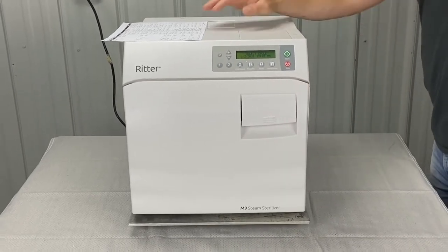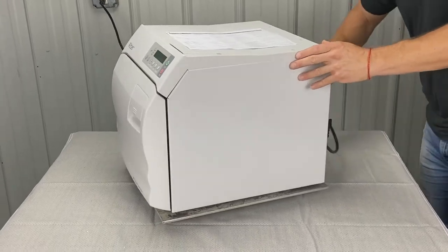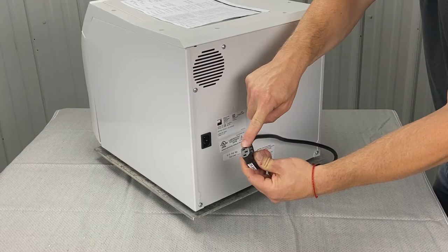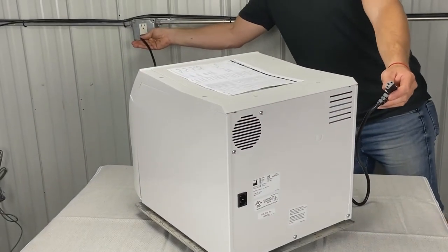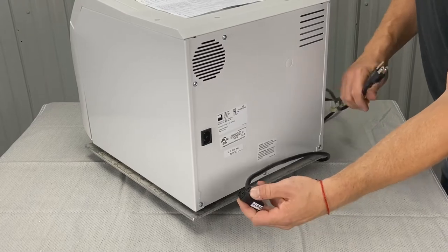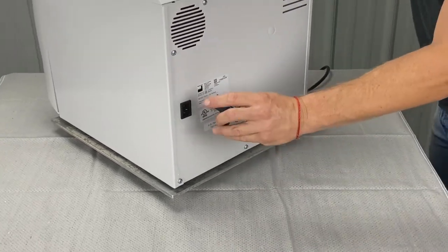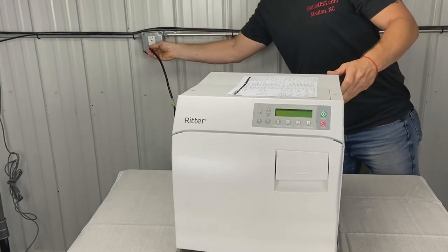We're going to check the power cord connections. Spin it to the back — as you can see, this is a detachable cord. You're going to want to pull this off and inspect it. Pull the power from the wall first, then unplug here at the machine. You're going to want to look for melted or swollen connections, and also look for melted or swollen connections right around these posts. Then plug it back in at the back and then back into the wall.